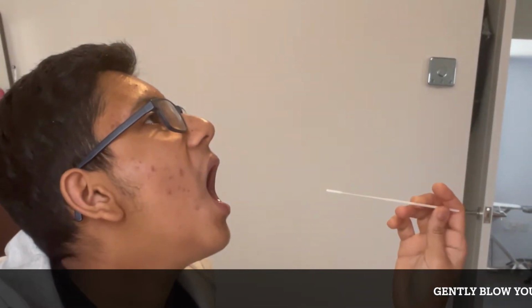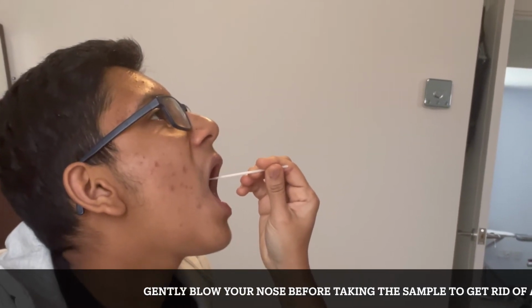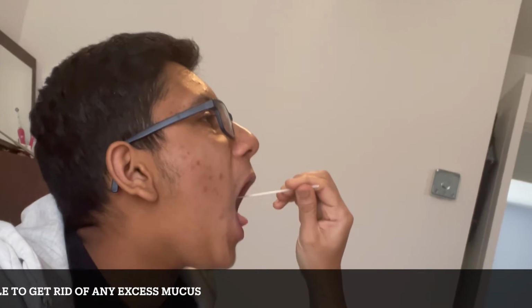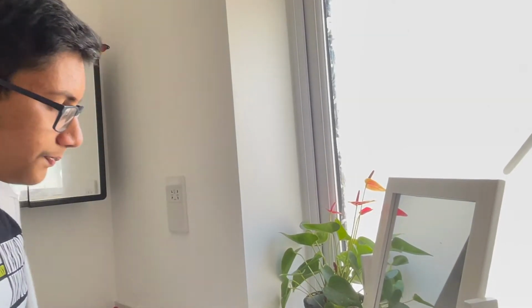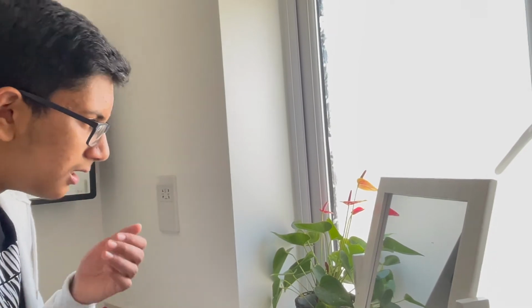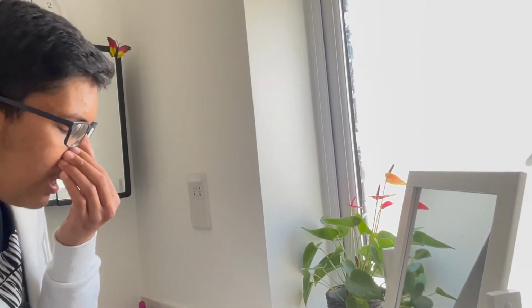Before you start your test, gently blow your nose into a tissue and throw the tissue away in a closed bin. Holding the swab between your fingers, open your mouth wide and rub the fabric tip of the swab over both tonsils or where they would have been. Do this with a firm contact 4 times on each side. Put the same swab gently into one nostril until you feel a slight resistance. Roll the swab firmly around the insides of the nostril, making 10 complete circles. This may feel uncomfortable. Do not insert the swab any deeper if you feel strong resistance or even pain.